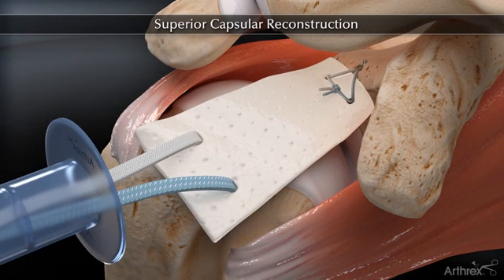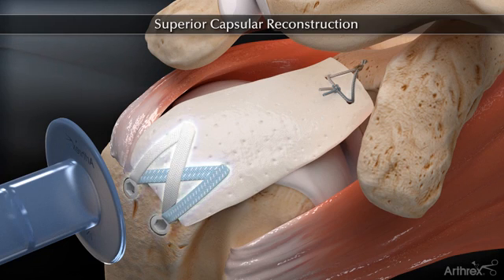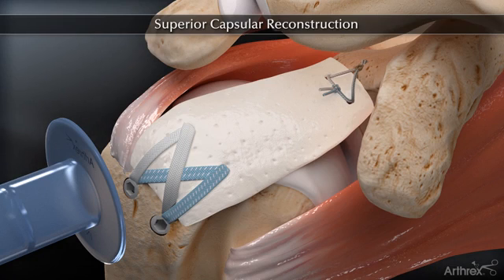Once the medial side is complete, the humeral side is fixated using a standard knotless speed bridge repair to maximize fixation strength and enhance footprint compression between the graft and bone.